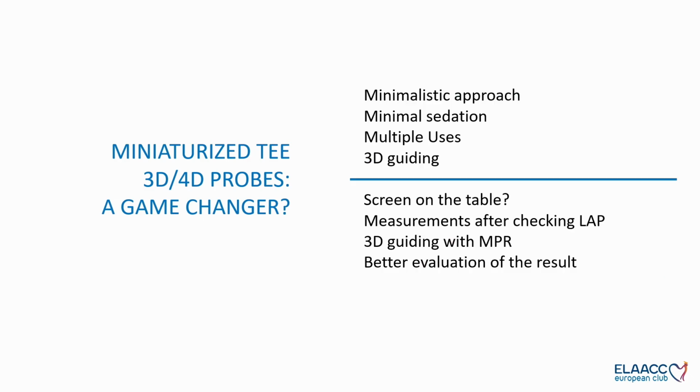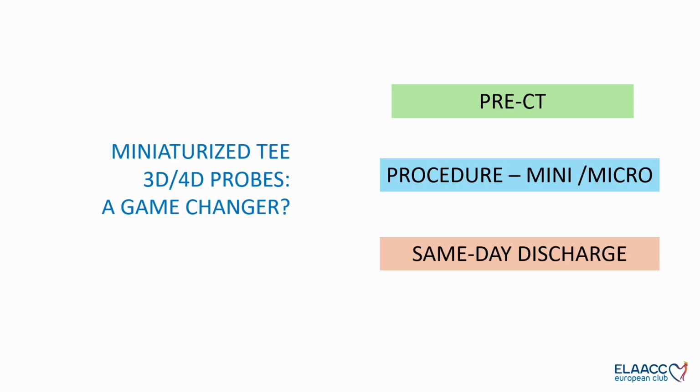But probably with these new probes, as Laura has just shown, we can consider screening the patient on the table, and we can take measurements again, we can do 3D guiding, and probably we can get a better evaluation of the results. So it's something we can discuss, whether we can take the pre-CT out of the equation if we are using this new 3D and 4D probe. Probably that is what we are planning to do. We have just begun to use the 3D probe, so maybe it's something we can consider.